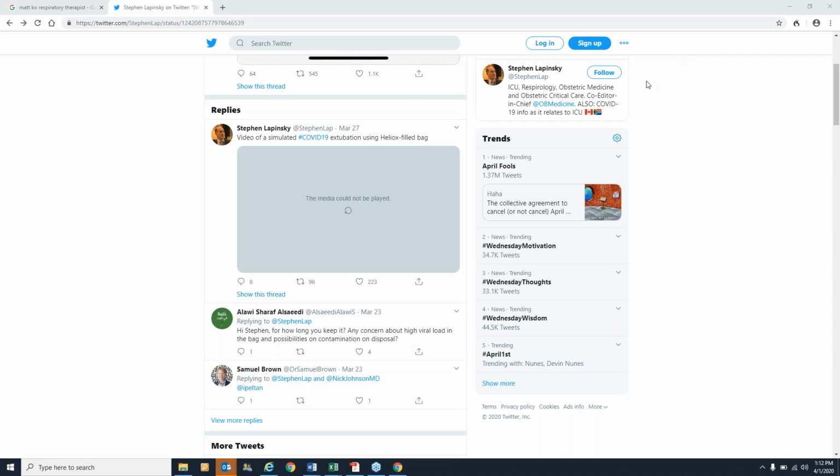Really, though, a lot of the pressure fittings, at the Y for the circuit, for the corrugated tubing to the inline, unless they get wet, they're pretty strong and robust. For our proning of COVID patients, we did put that clause in to make sure that before you prone, you are ensuring every single connection from the vent and then circuit is tightened up, just to prevent that accidental disconnection. I'm not sure how much tape reinforces that.